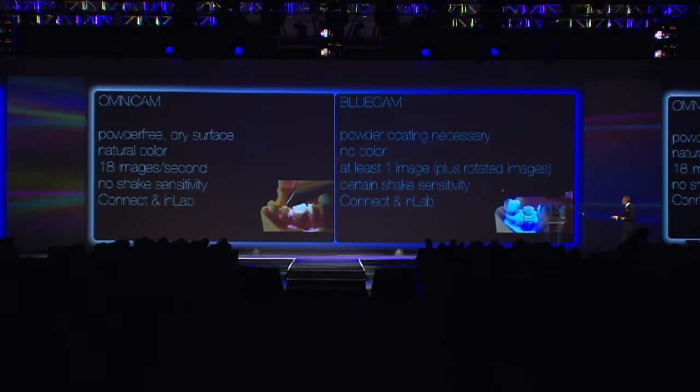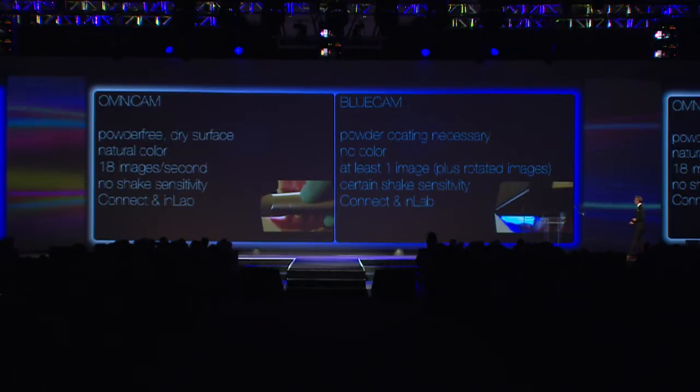There is no shake sensitivity with the OmniCam, and with the blue cam we have a certain shake sensitivity. If you are shaking, we can't do good optical impressions. And both cameras we can use for the Connect and the in-lab software as well.